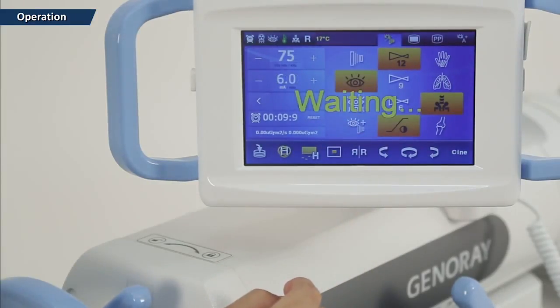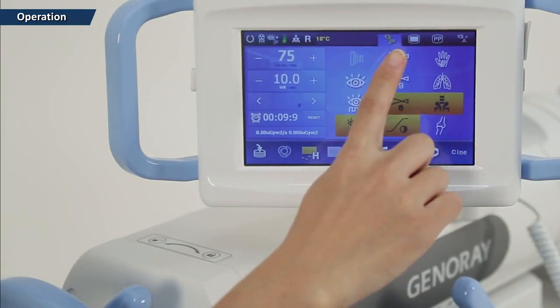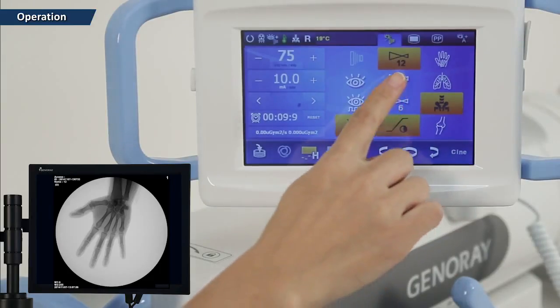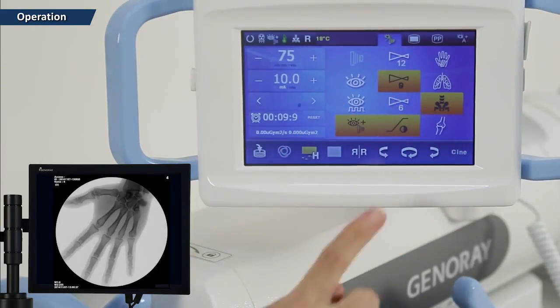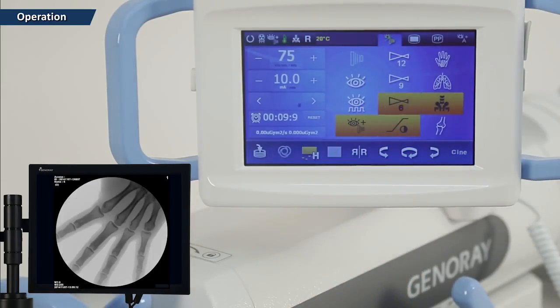Continuous fluoroscopy mode is the most commonly used mode. When the image intensifier is 12 inches in size, you can choose to see it as 12 inches, 9 inches, or 6 inches. When the image intensifier is 9 inches in size, you can see it as 9 inches, 6 inches, or 4.5 inches.